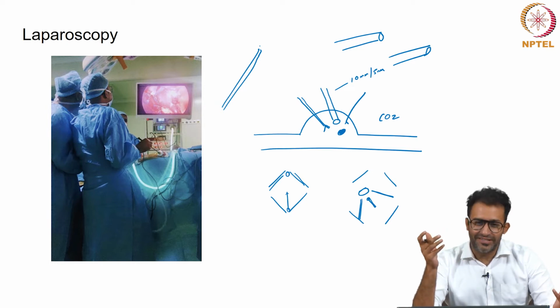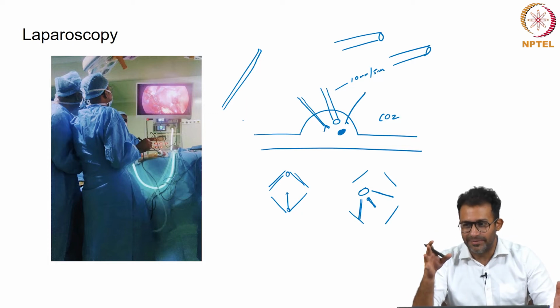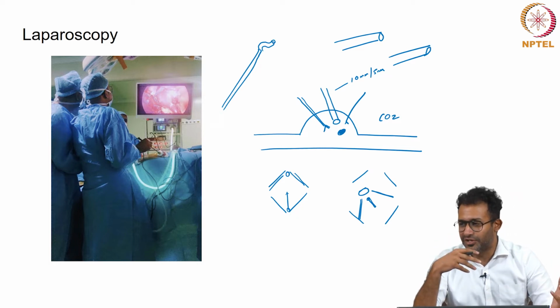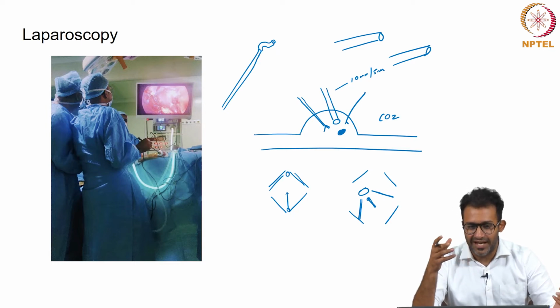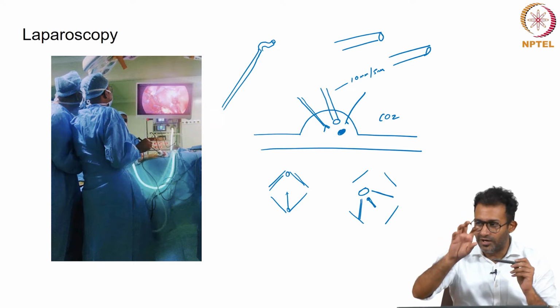So robotic surgery is essentially a kind of laparoscopy where the principles are the same as laparoscopy, except that the instrument at the end has a wrist-like motion. So what we call the degrees of freedom. The most commonly used robot is the Da Vinci robot, produced by Intuitive Surgical, and it has 7 degrees of freedom, which allows you to manipulate organs.